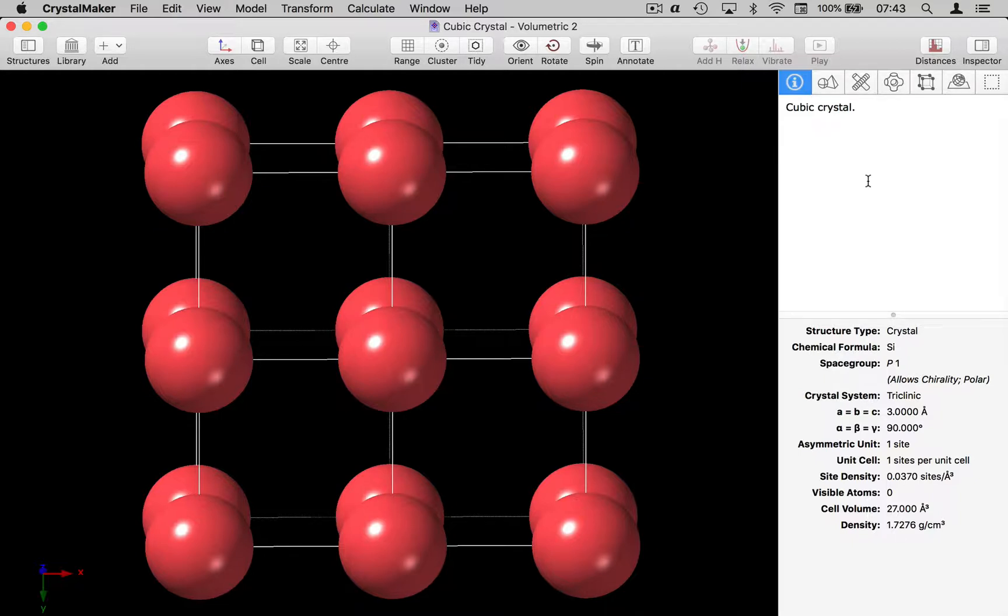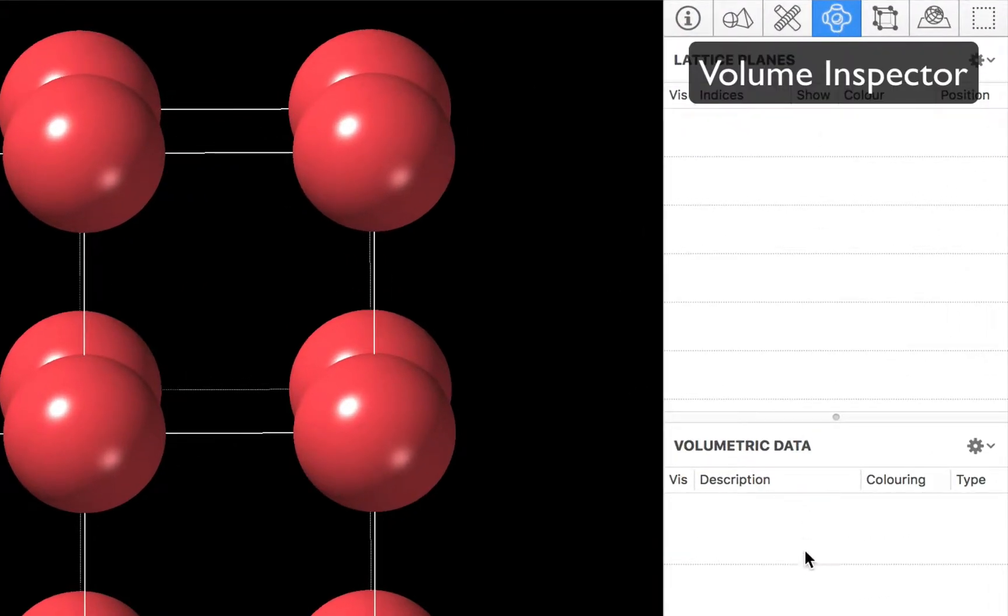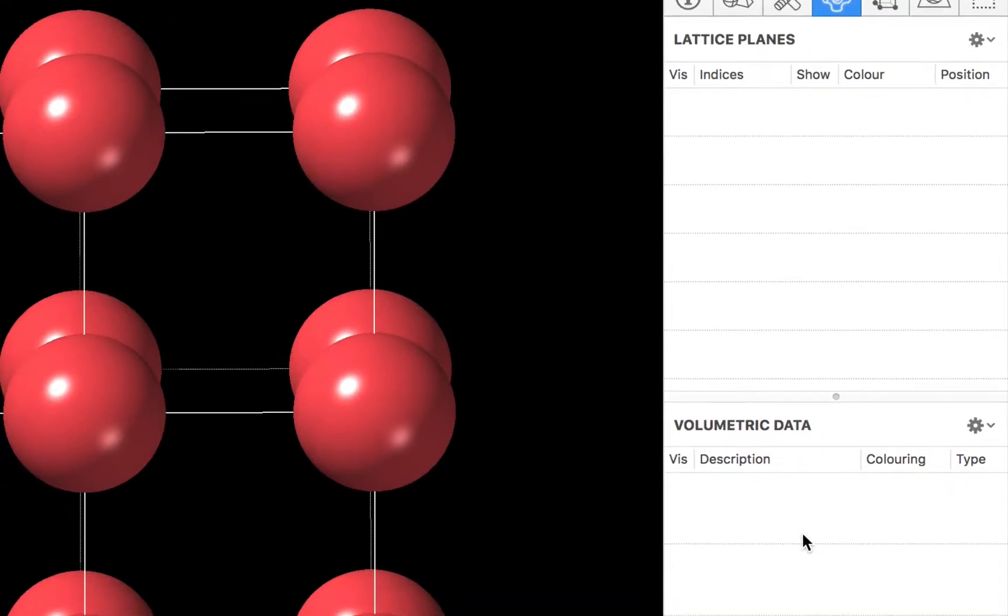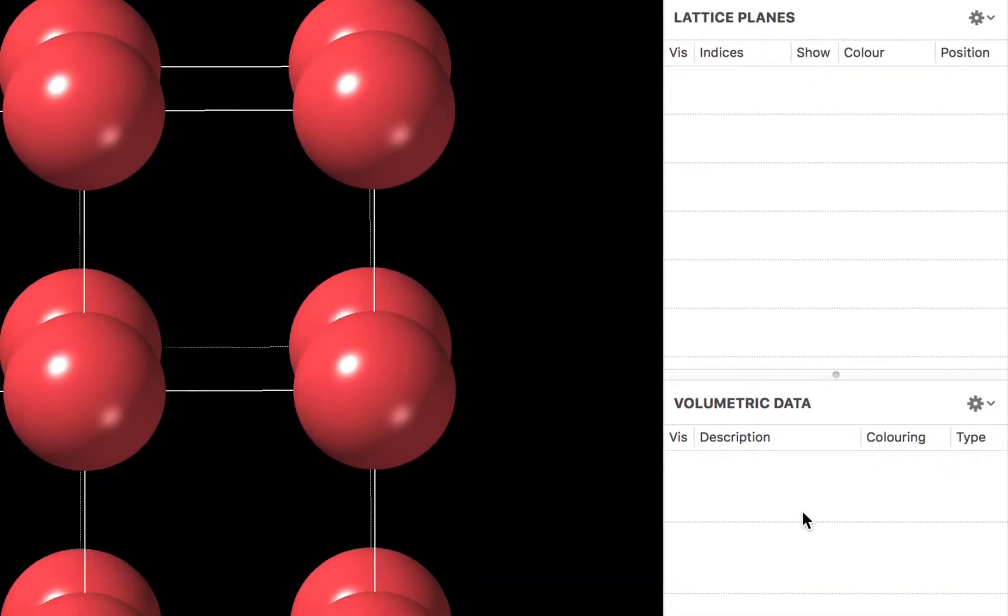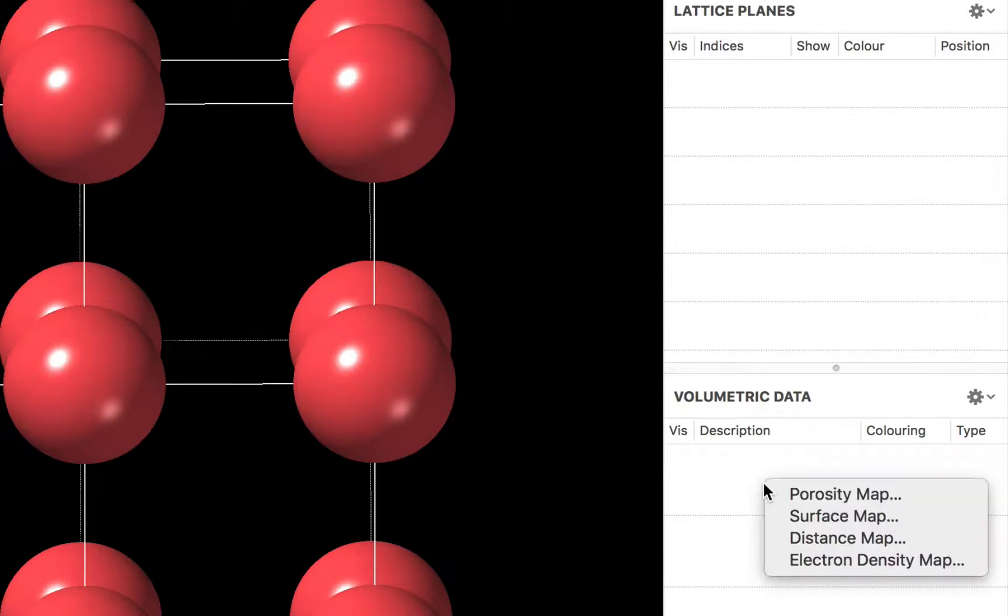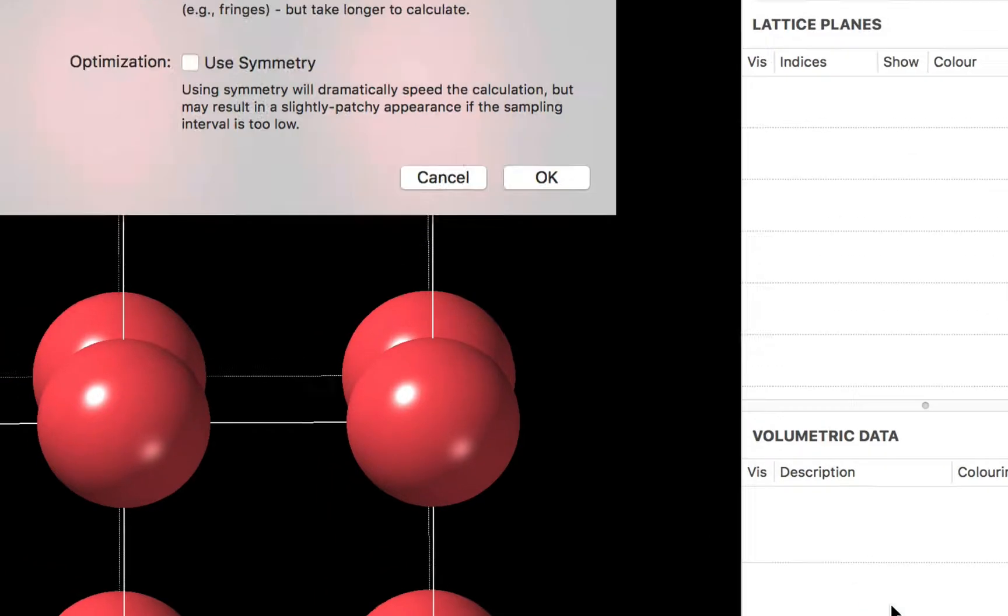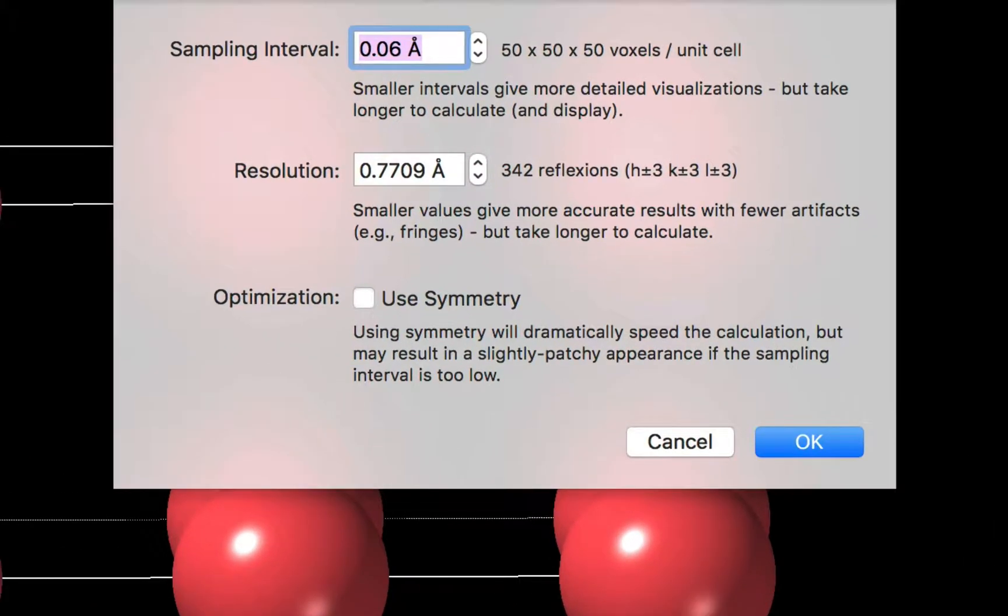So the first thing I'm going to do is go to the volume inspector and we're going to add a new volumetric data set by double-clicking in the list. We're going to create an electron density map and I'm prompted to enter the parameters for my electron density map.